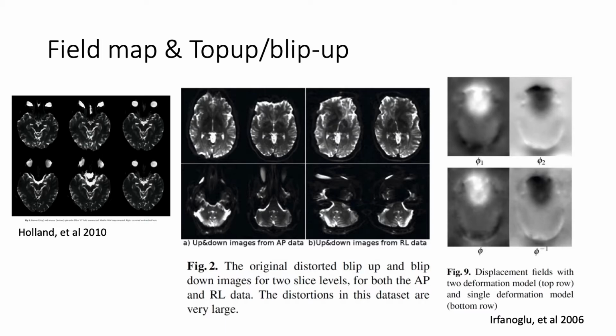Let's see if this is the one where you can see there's missing brain, or a dark spot. Basically, you can recapture some of that. I guess that helps to know if it's working. Depending on your signal, there are also quality assurance and quality control statistics, where you can center on those regions and see what your signal is. I don't know if anyone else has other ways to know whether or not it worked.